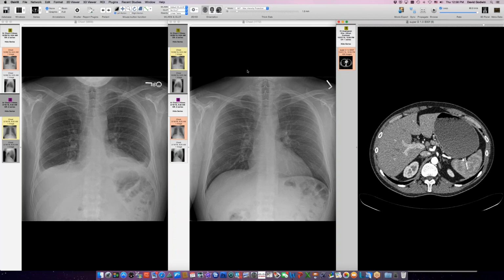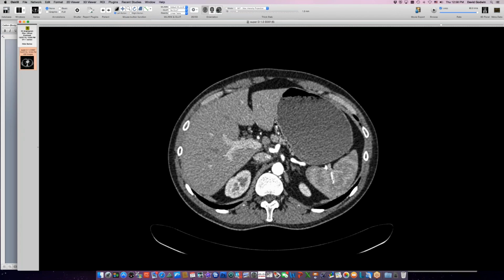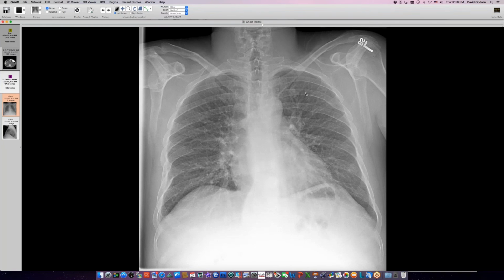So we might have some more from a muscle biopsy. Is it some kind of immune-related myositis that's somehow pathogenetically related to graft versus host disease? I don't know what the mechanism is, but if it's like other things, there may be a cellular infiltration. Let me show you this other case of a man with a near normal chest radiograph here, but it's got some bone disease. It's got some enlargement of bones and some pathologic fractures.